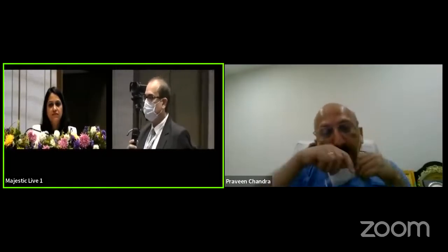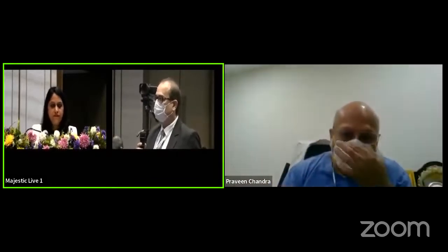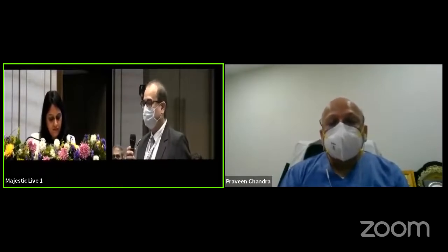The only one thing I would say is we also had one case last week where we had a good collaboration with a cardiologist, where we did a hybrid procedure. The patient had a LAD which was 90% blocked, and we had a LIMA to LAD. And when we required an aortic valve, he's an 80-year-old gentleman who had a renal dysfunction. And we had not done an aortogram preoperatively. And when we found on the table that the aorta is porcelain, we were kind of stuck. So the whole of the aorta was like calcium, and there was just a small spot through which I thought that we could pass a guide wire.